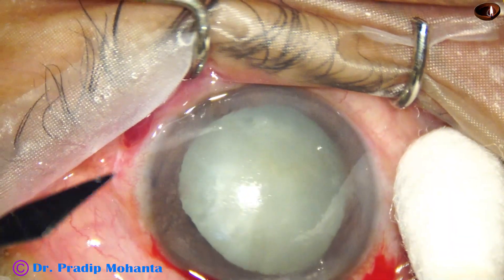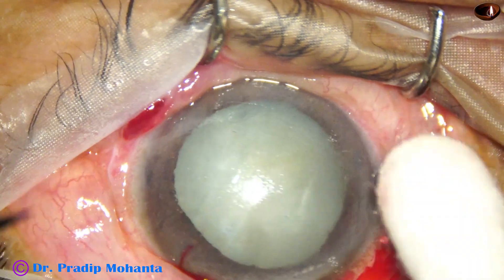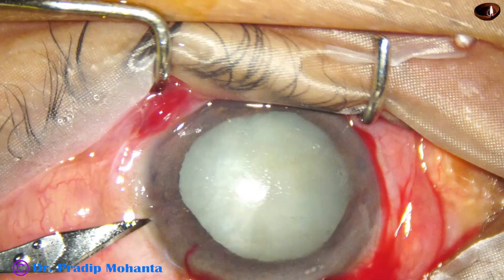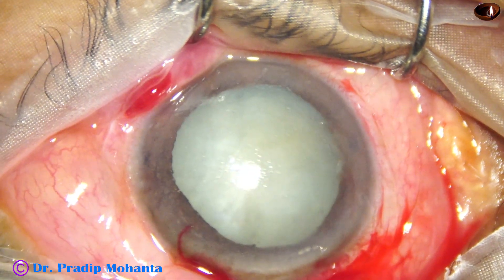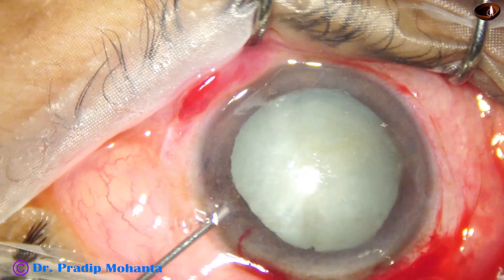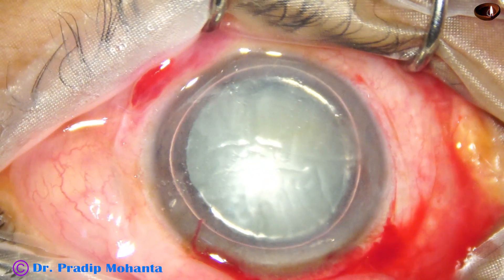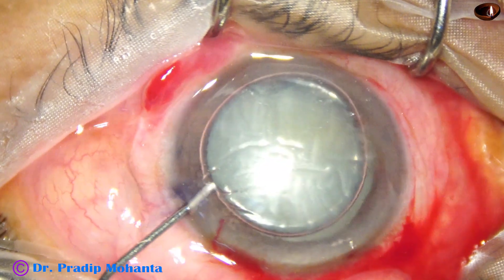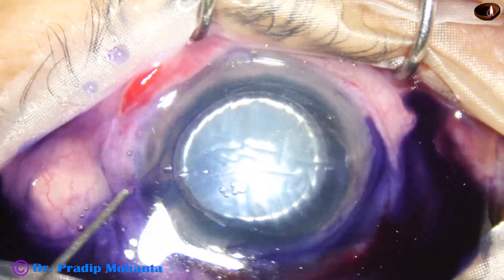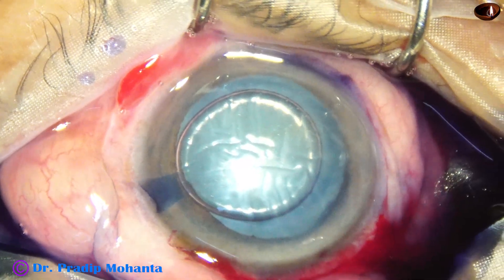I am going to place the side port incision first. The cornea has become a bit clearer after the vitreous tap. This is the side port. There is some release of aqueous, and this is an air bubble. You can see the Descemet's membrane folds after injecting the air bubble in the anterior chamber.